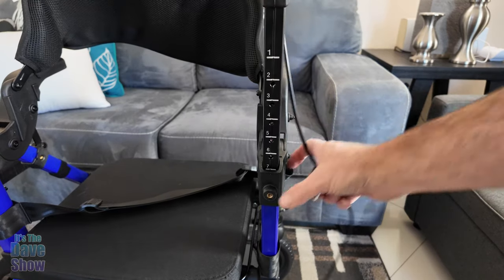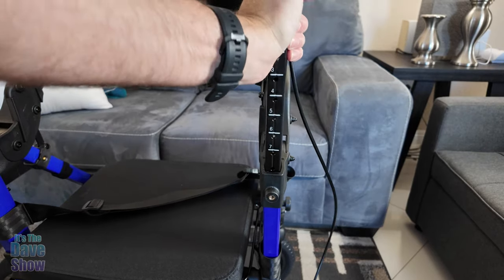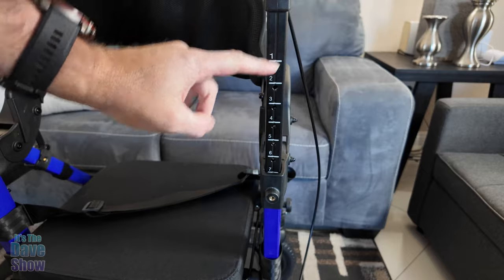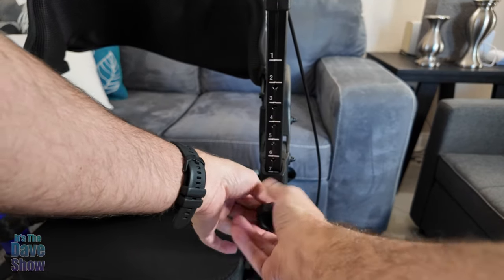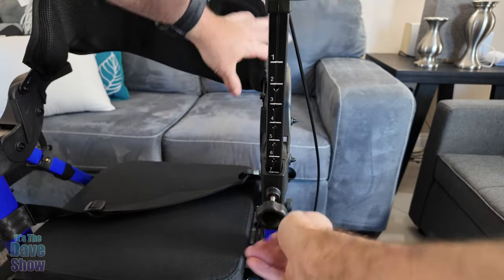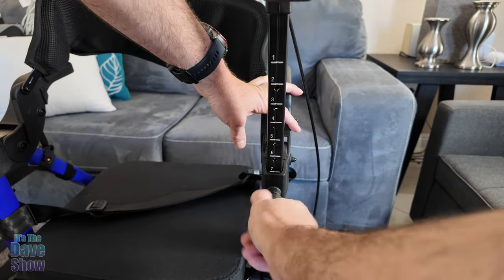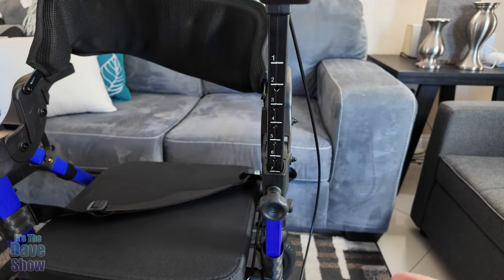Next is to put the handles in — they just slide right into the hole. You can see they have different levels, one through seven. I'm going to put it on the highest one for now because that's what my mom likes. You can adjust it any way you like.